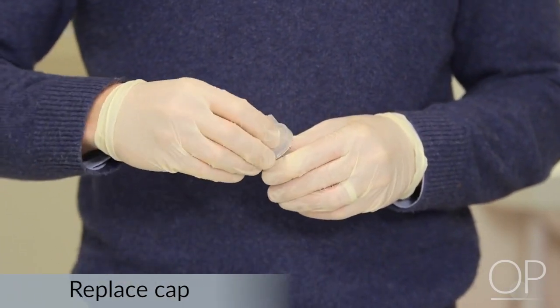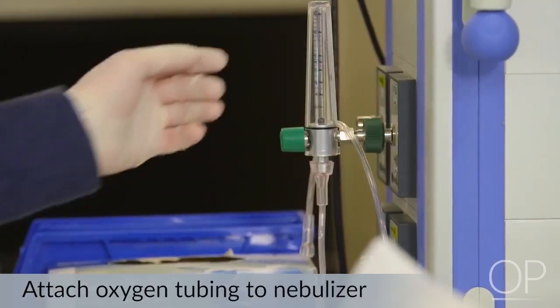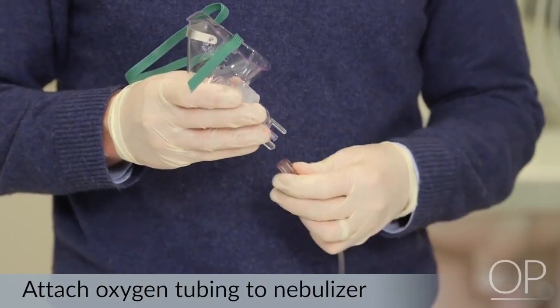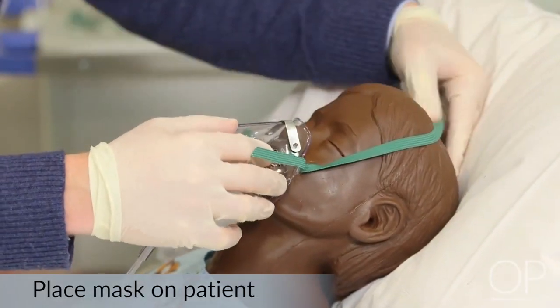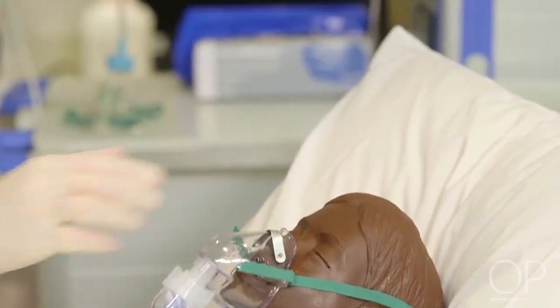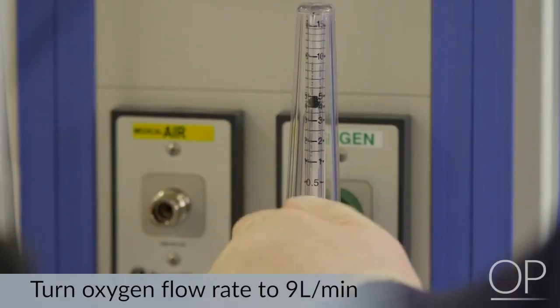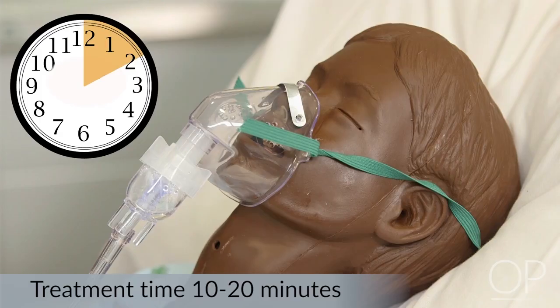We're going to replace the cap, attach the interface, affix the oxygen tubing to the bottom portion of the nebulizer, and place the mask on our patient. I'm going to turn the oxygen flow rate onto 9 liters per minute as per recommendations by the manufacturer. This treatment should last anywhere from 10 to 20 minutes.